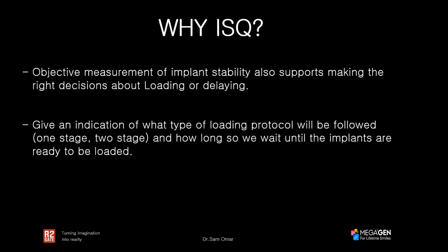So why ISQ? Why would I need to use ISQ? The ISQ is an objective measurement of implant stability, and it also supports making the right decisions about loading or delaying, as you just saw in the previous cases. It gives an indication of what type of loading protocol will be followed, whether to do 1 stage or 2 stage, and how long we wait until the implant is ready to be loaded.